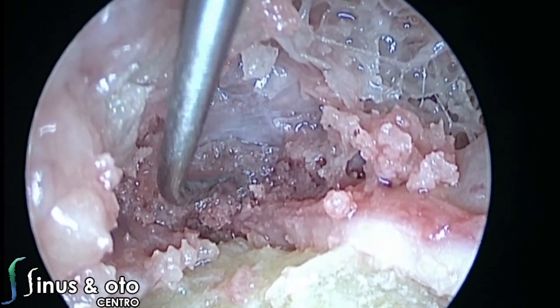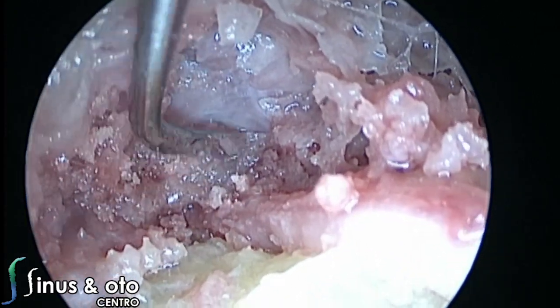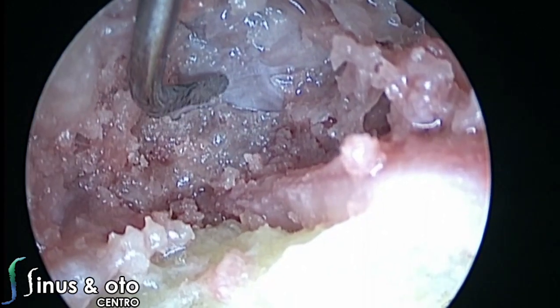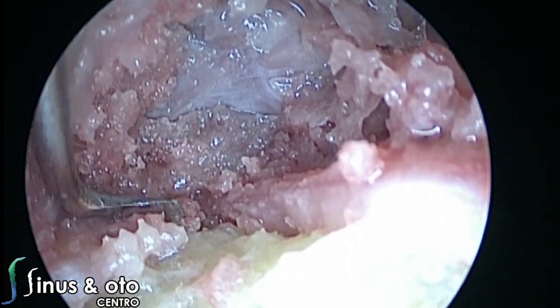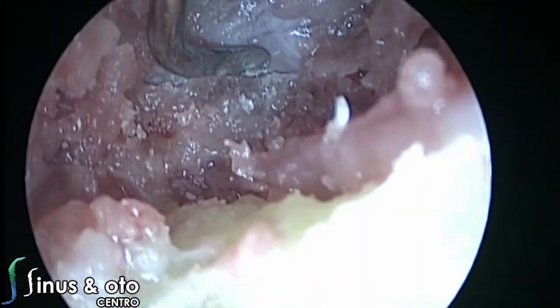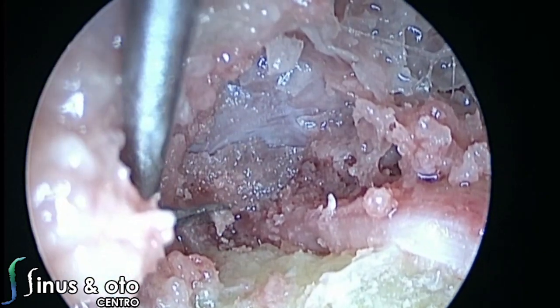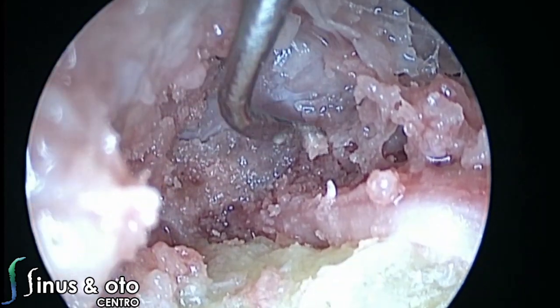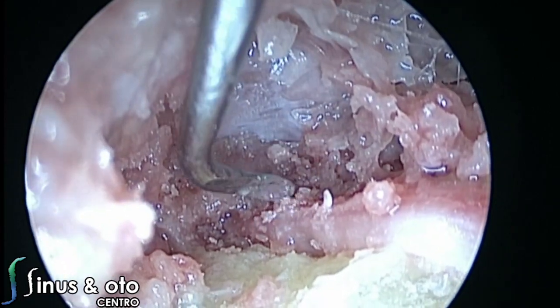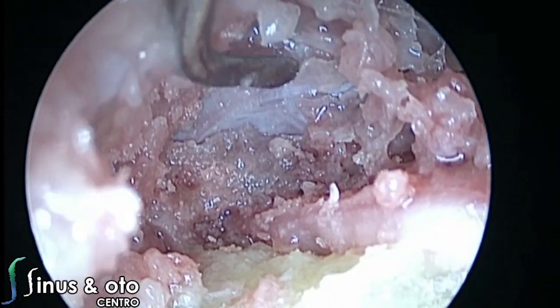So we have this very close relationship between these structures, and also you can have this kind of endoscopic approach, the transcanal suprageniculate approach, sometimes also to the petrous apex, of course, using the endoscopes and avoiding, whenever possible and whenever you have the skills and the correct instruments, more open radical approaches. So the middle fossa dura is there.